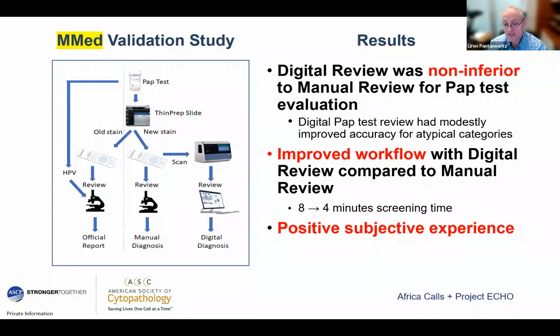Because once I looked at the case and I saw those koilocytes and I knew this is a low-grade case, and I couldn't see anything else, no bugs, no high-grade cells, and I trusted the AI, I was happy to make a diagnosis within seconds.